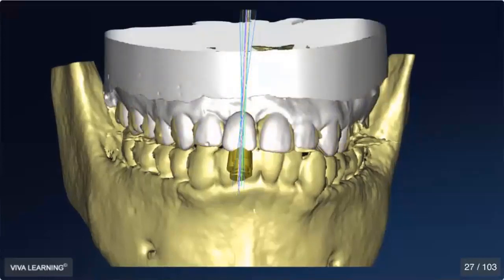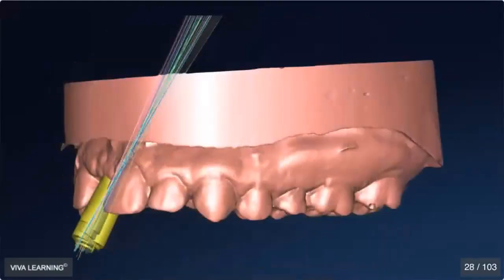However, if we do a true diagnostic wax up, then we are seeing some significant difference statistically. In this case, maybe not clinically relevant, but we are seeing differences compared to a full diagnostic wax up. What does the full diagnostic wax up entail? Well, mainly we're adding occlusion into the equation, which is really hard to do on the CT scan only. And again, on a single site, it may not be so dramatic, but let's think about another scenario.